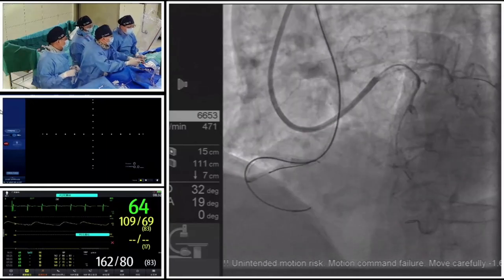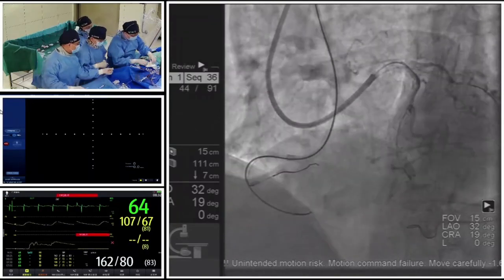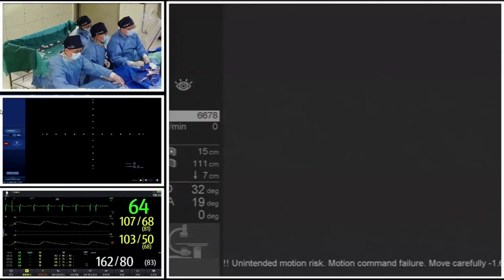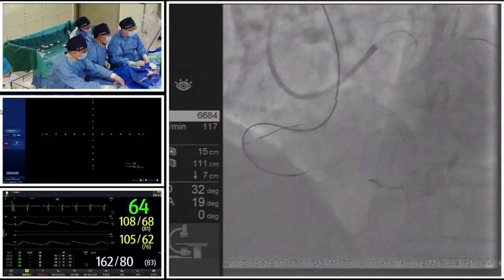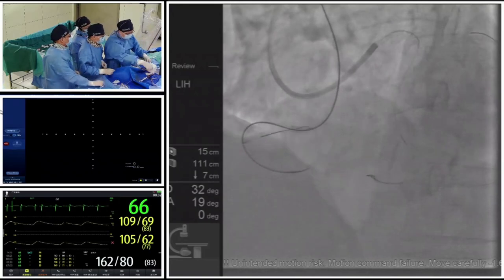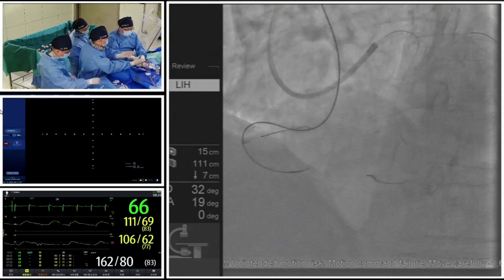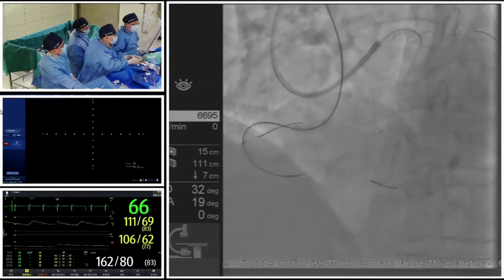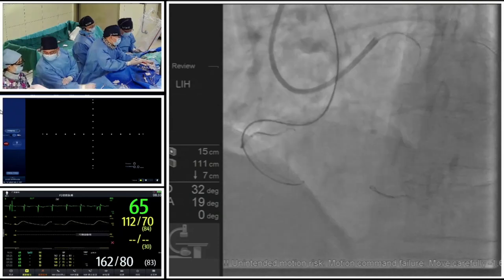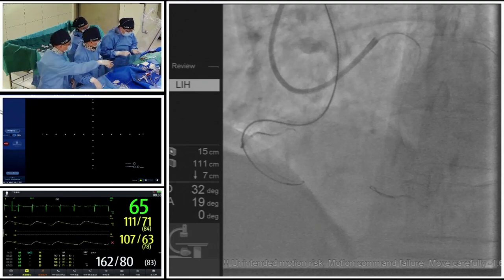Yes, this is of key importance because we can see that after you perform the knuckle technique to cause the subintimal tracking, it is of key importance to avoid antegrade injection. So, why didn't we withdraw the retrograde wire? Because the retrograde wire also could be used as a landmark. So now we are using the retrograde wire as a landmark to guide the antegrade wire puncture.